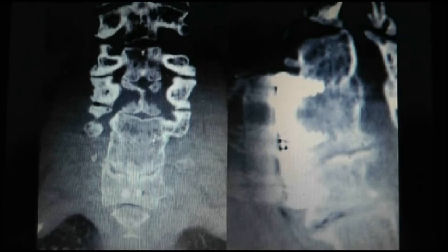So it just goes all the way across. It's like one big long bone. And this space, it didn't go all the way across. It just didn't heal. And the other thing is, these people get a hypertrophic non-union, see that? So it's in a bad place, it's in the spinal canal.